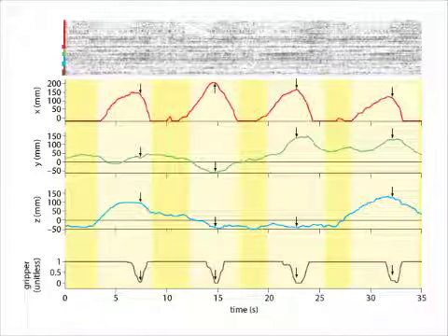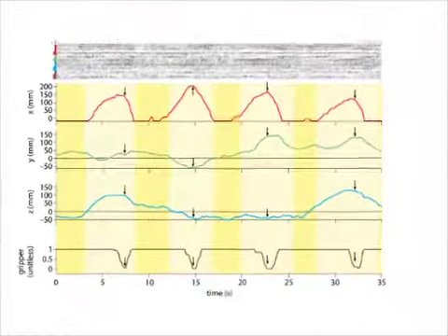Arrows indicate the moment the gripper closes on the target. Given the monkey's success in grabbing the marshmallow, it is clear that movement direction can be successfully predicted by the population activity of motor cortical neurons.